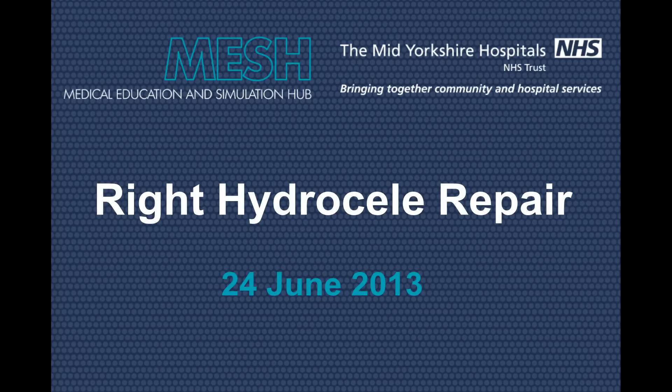This video shows correction of right hydrocele using an animal model of a bull's scrotum. Preoperatively, we must make sure we have correct imaging and clinical findings.